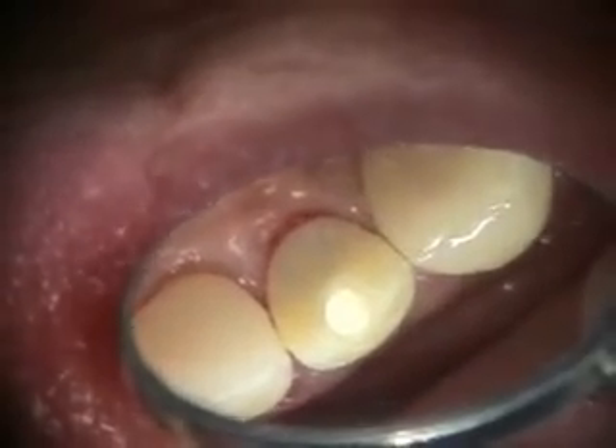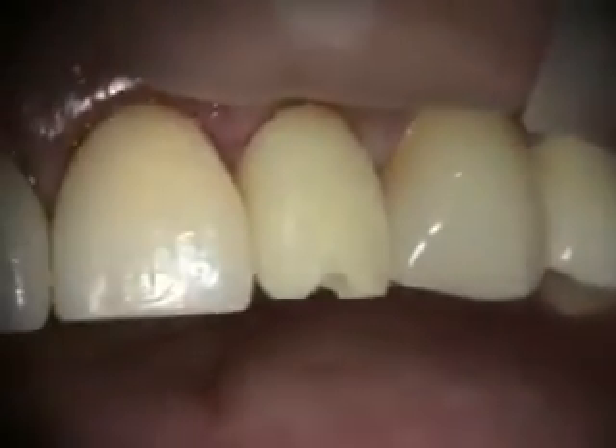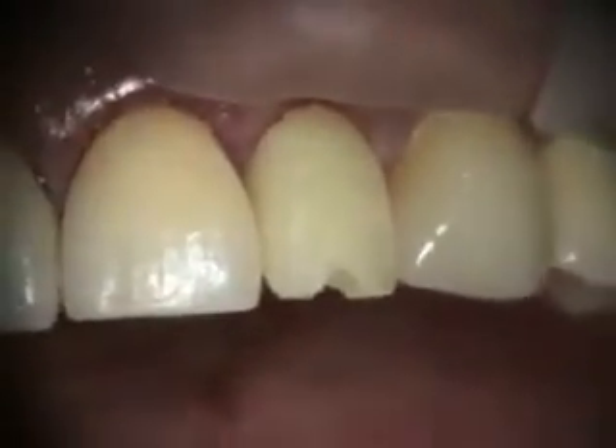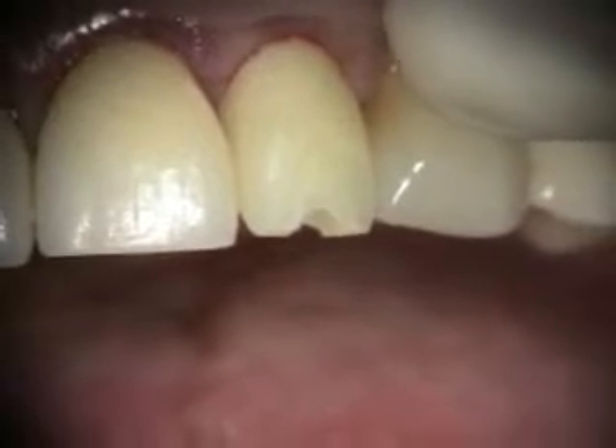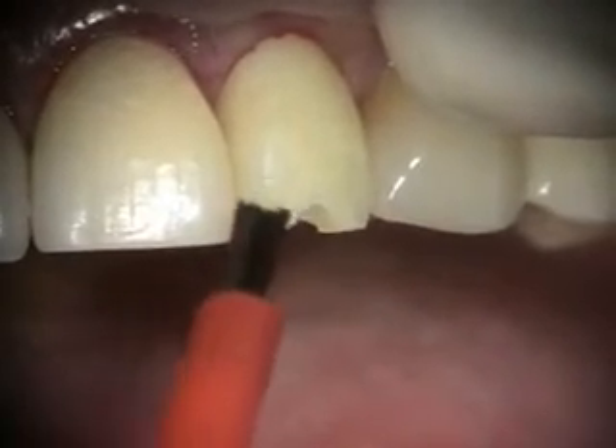We're going to fill that in and then I'm going to add a little bit to the incisal edge here on the corner. But in order to get it to stick, I'm going to need to paint on a little bit of monomer here.